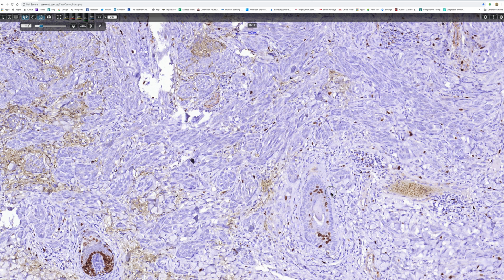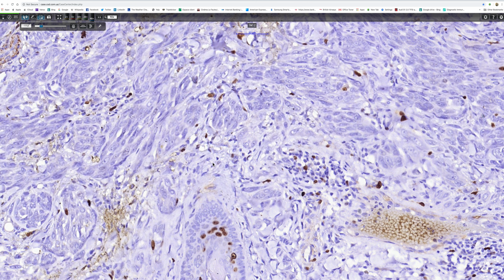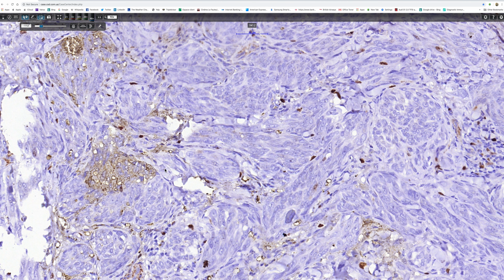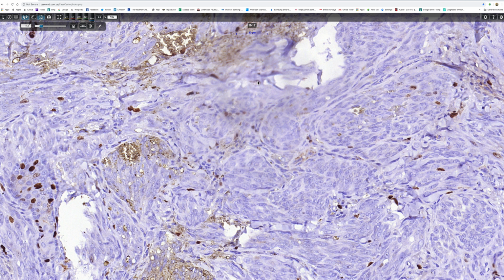Lymphocytes sometimes take up Ki-67, and that could confuse the issue because then you're not sure what's positive. But it's quite interesting. There are a few lymphocytes in that cluster there, and the odd cell here and there, we don't know what those are, but they're probably lymphoid cells. But it's very obviously and strikingly negative.